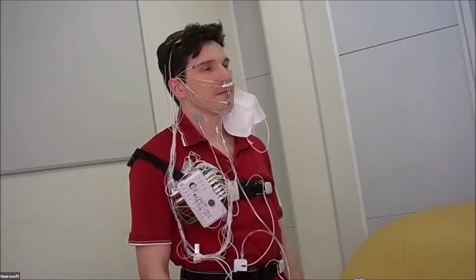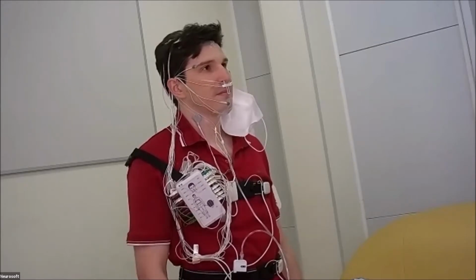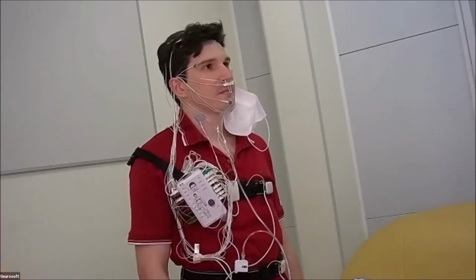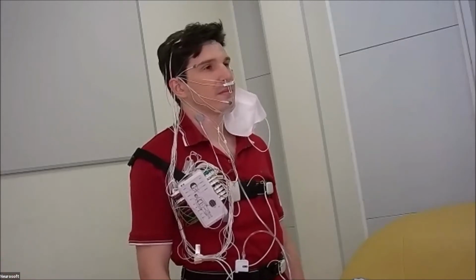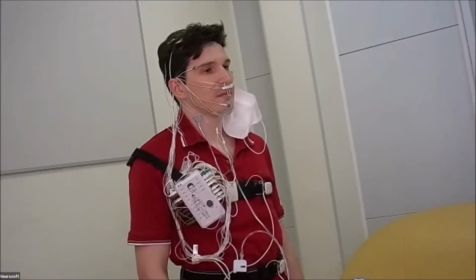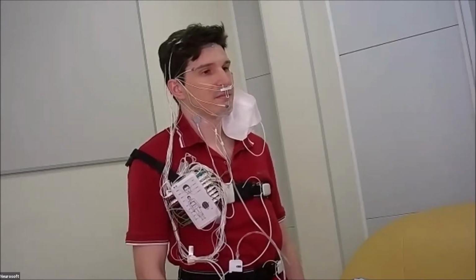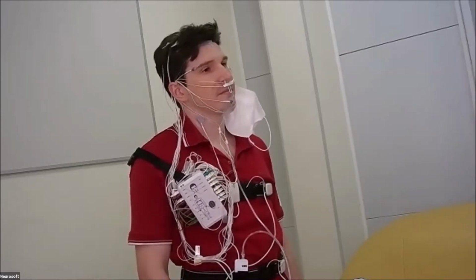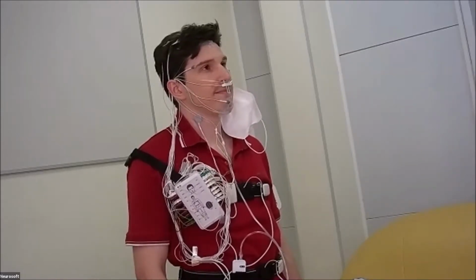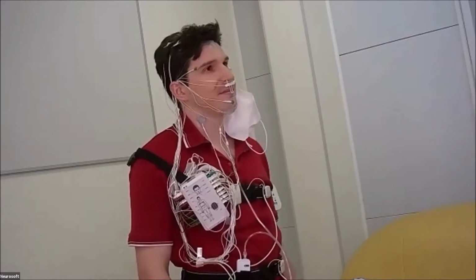In accordance with the American Academy of Sleep Medicine recommendation, we need 1 EMG derivation for sleep staging. We use bipolar derivations, but we fix 3 electrodes. The third electrode we need in case the main electrodes malfunction, so we put this electrode just in case, as we did for the EEG.